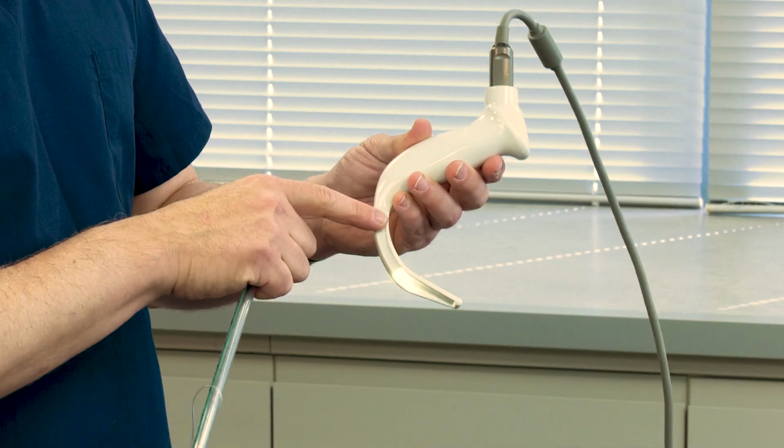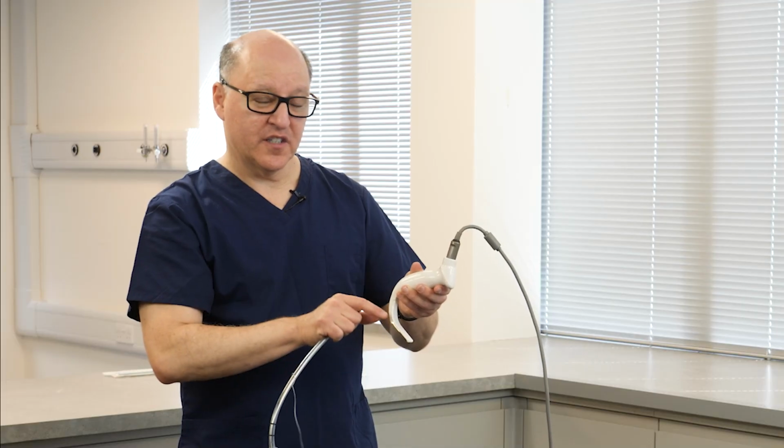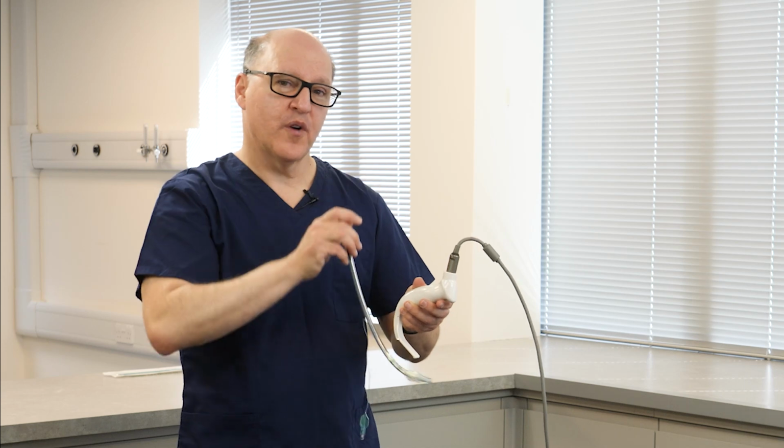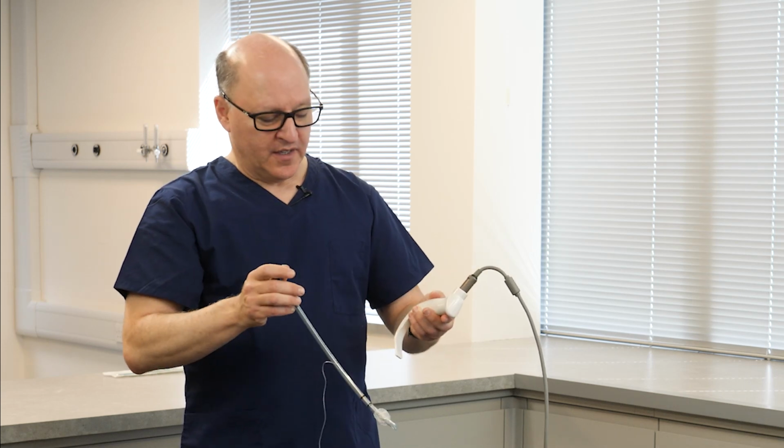Because with hyperangulation, you don't have a direct visualization of the target, but you have to get the tube around the curvature of the blade.